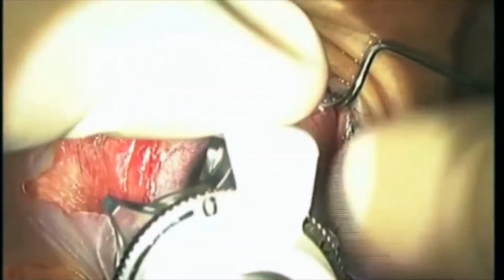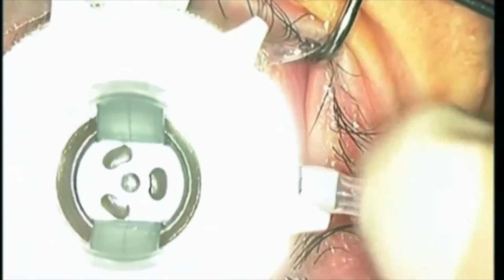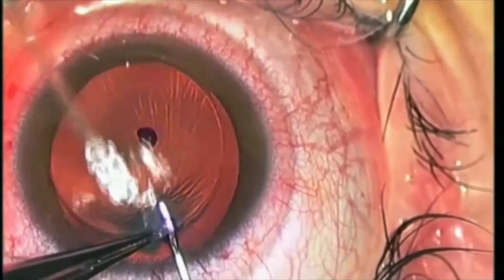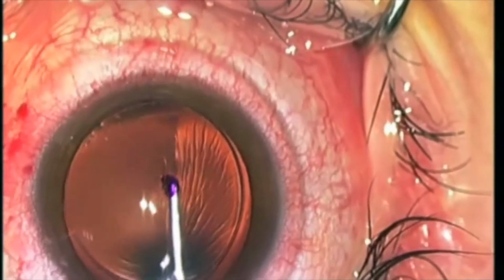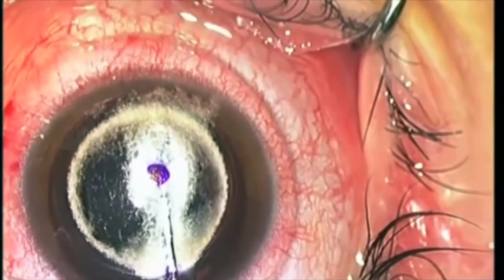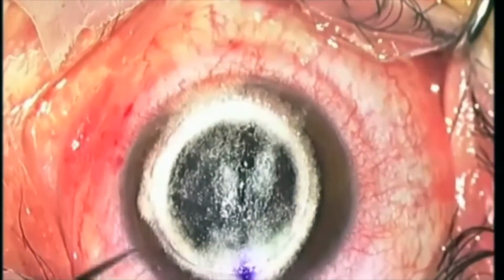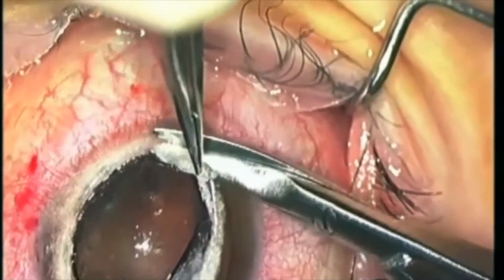The most famous and worldwide used technique for stroma transplantation is the big bubble technique developed by Mohammed Anwar, that I'm very briefly describing in this picture. The key is to create a detachment by a pneumodissection, by injection of air in the deep stroma between the posterior stroma and the endothelium. And this allows to selectively dissect and remove the stroma, for example, in this case of keratoconus, and isolate the Descemet membrane together with the endothelium and replace the stroma with the donor stroma.